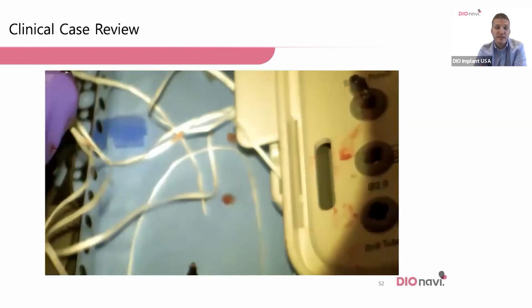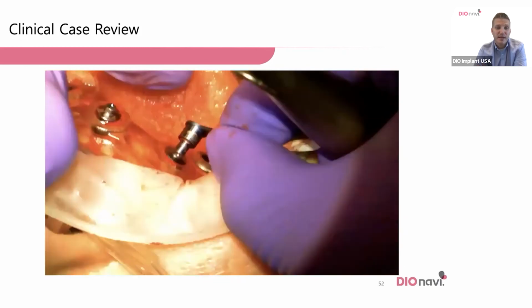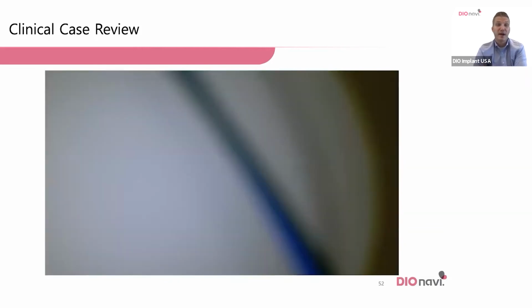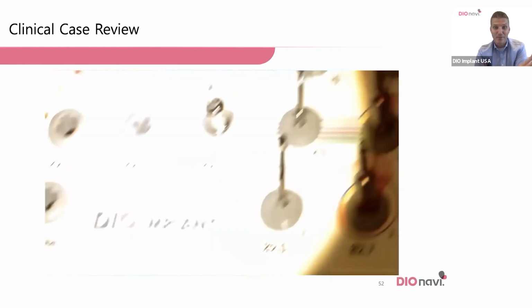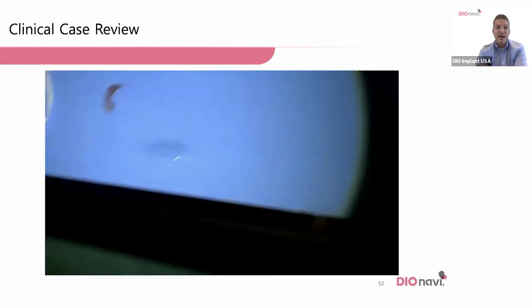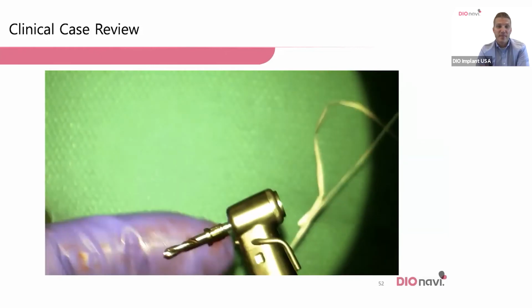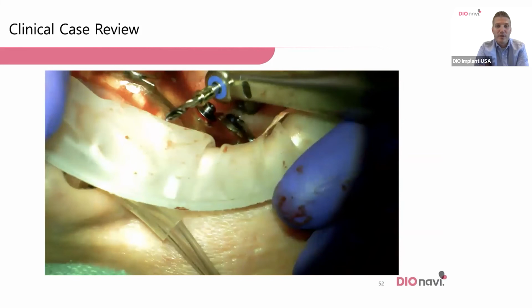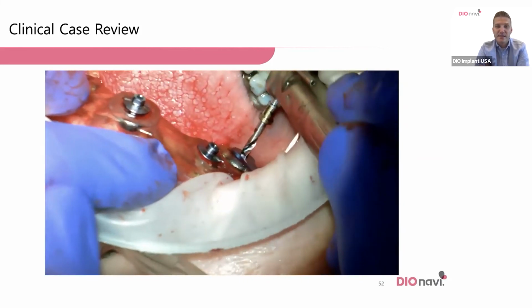So here is my sleeve and tube. I'm going to put the tube in place, but now this is a sinus kit or sinus case, remember? So I need to grab the depth stop. So I'm probably looking at my papers there. What's the number of my drill stop? I go up to the kit and I find it and I push that on. And that is the magic, if you will. In the virtual world, we planned exactly how much space was needed, and this stop provides that.